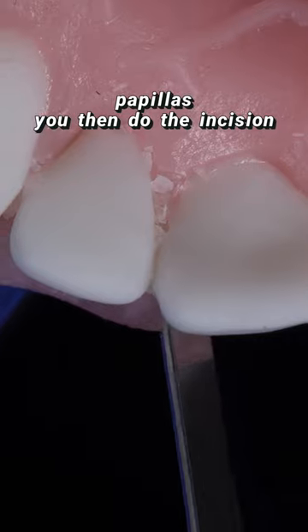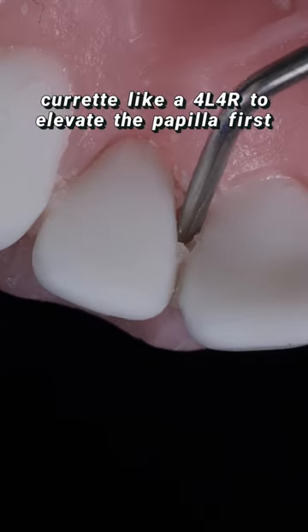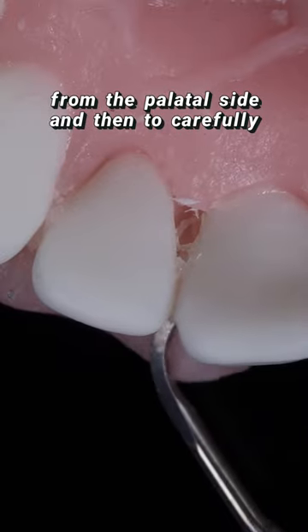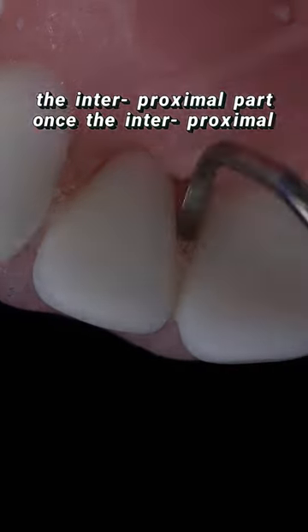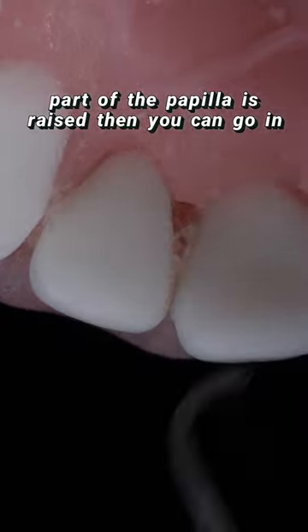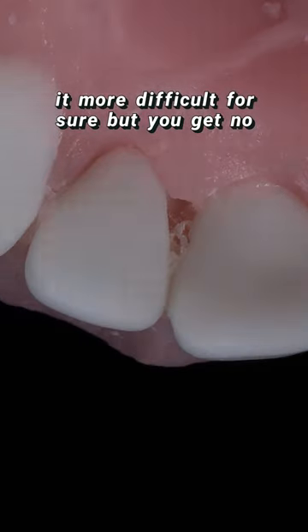You then do incisions on both sides of the papilla to complement the one on the palatal side, and use a very small curette like a 4L4R to elevate the papilla first from the palatal side, then carefully reach through from the buccal side and lift the interproximal part. Once the interproximal part of the papilla is raised, you can go in with a Buser elevator and lift it. This makes it more difficult for sure, but you get no scarring.